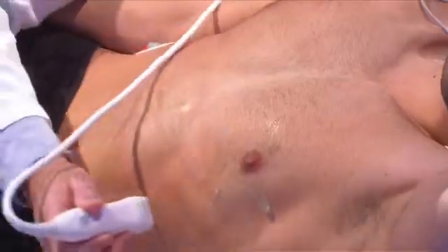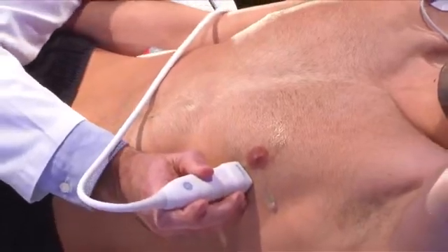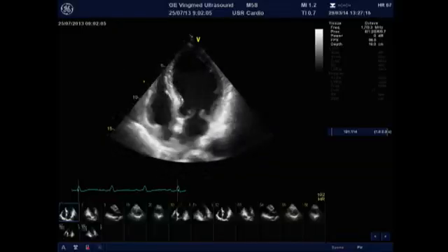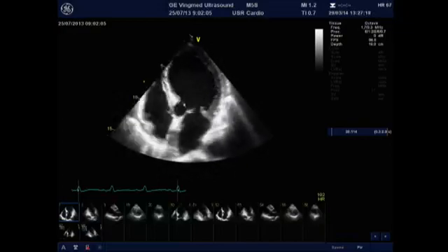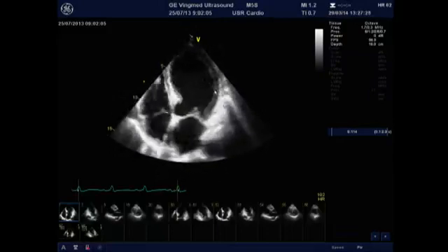Of course, it was obvious he had to go to the cath lab, but we performed an echocardiogram just before the cath lab. This is the apical four-chamber view, where you can see that the basal segments are contracting okay, but the medial and apical segments, at least in all these walls, don't contract at all, and there is an apical bulging of these segments.